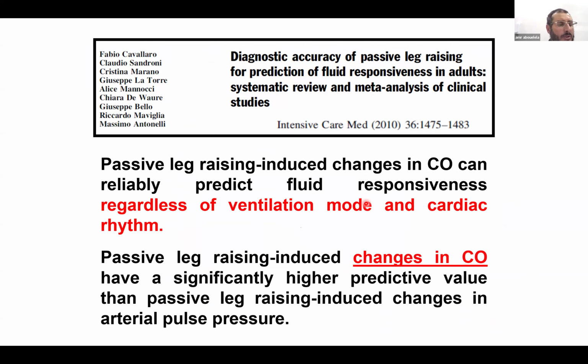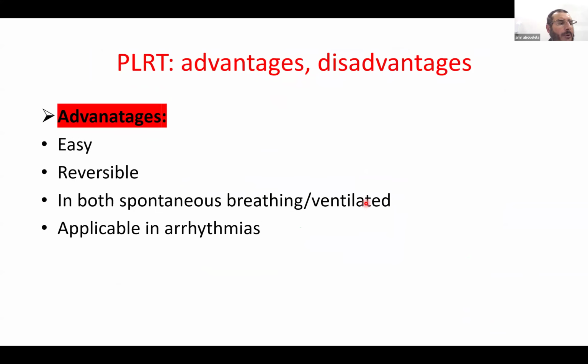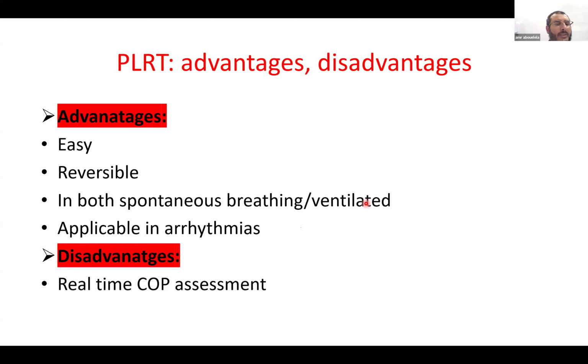The main disadvantage, or the main difficulty, is that you should have a real measurement of the cardiac output. Easy, reversible, in both spontaneously breathing and ventilated patients, applicable in arrhythmia. The main disadvantage is the real-time cardiac output measurement.